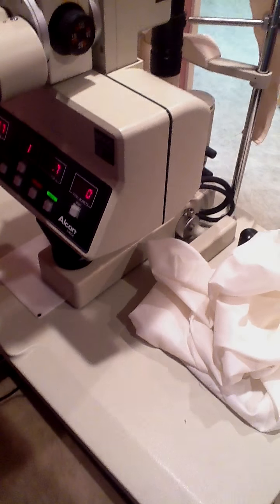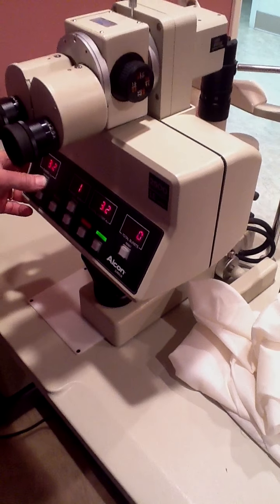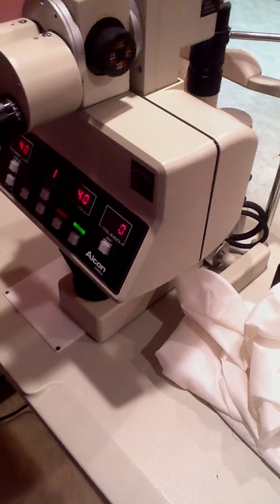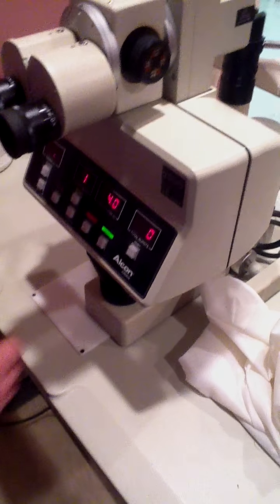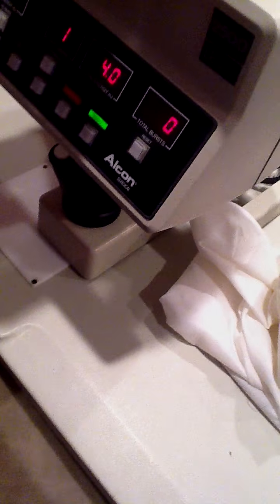This shows the energy. Usually when I'm doing YAG capsulotomies, I like the power to be approximately 4 millijoules — so that's what we have it set at. It's activated with this push button on the joystick. So let's just do a little bit of YAG lasering on this cardboard box.